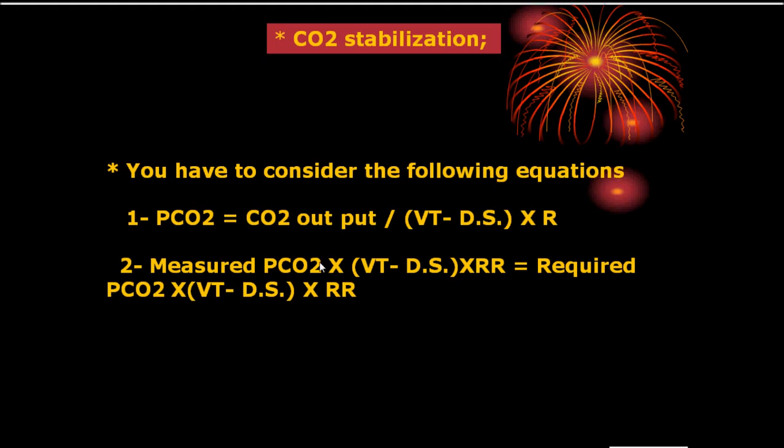Carbon dioxide: I have to adjust carbon dioxide. Carbon dioxide is usually adjusted close to normal, 35 to 40 millimeters of mercury. But in cases of COPD, it is something else. The target in COPD is to adjust the pH, not the carbon dioxide. How to adjust it? I put certain data on the ventilator. This is empirical data.